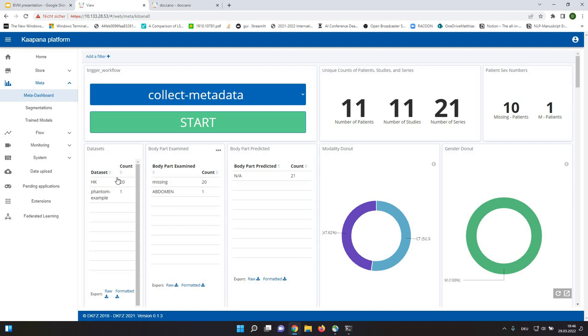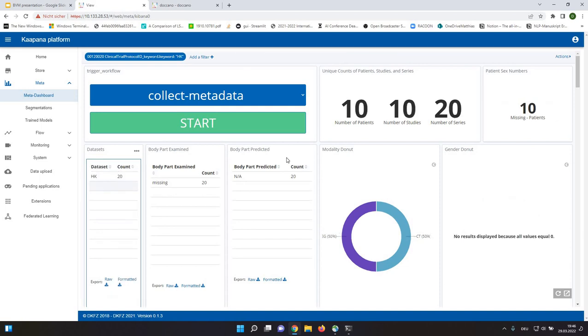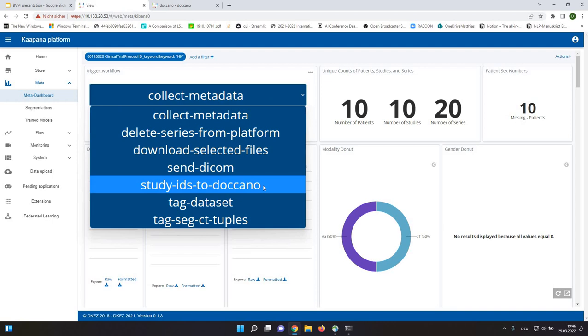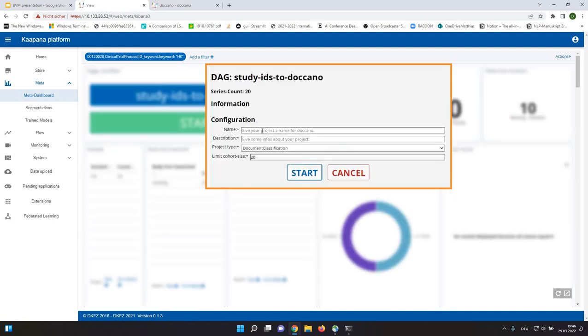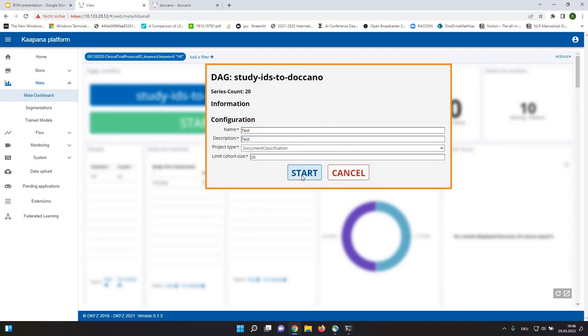I have sent already a dataset with a tag HK to this platform. And now I will execute our workflow called StudyIDs to Docano. And this workflow will create a project in Docano.